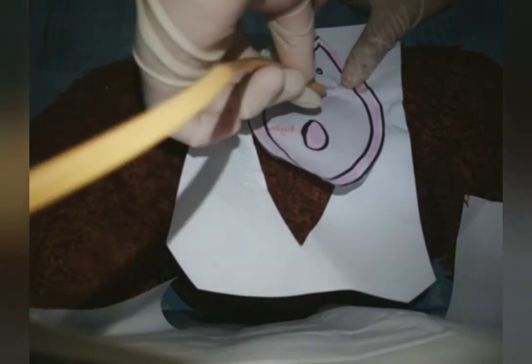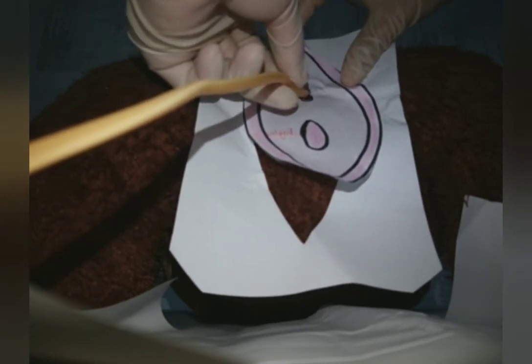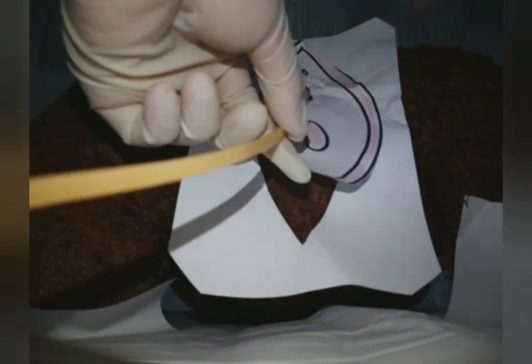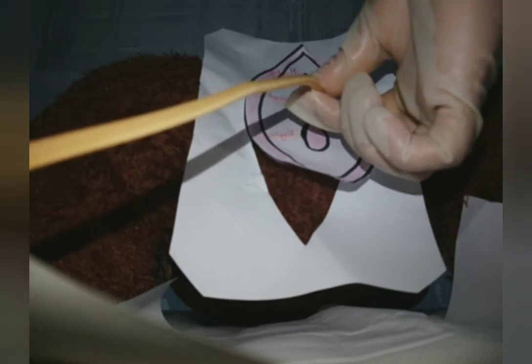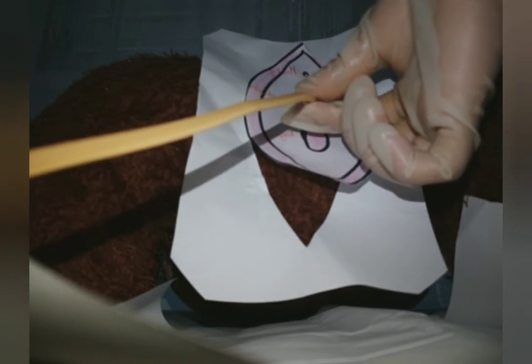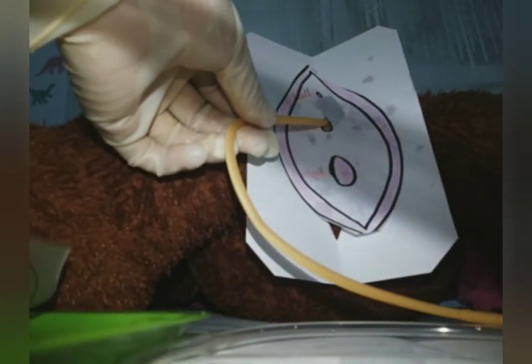So I will insert 1 to 2 inch in advance to be sure that it is fully in the urethra. So you will be successful when you see the urine in the catheter. So now with my non-dominant hand, I will hold, and with my dominant hand I will inflate the balloon. During this process, like when you're inserting the catheter, do not force the catheter into the urethra, which can damage the urethral tube. I will gently pull the catheter to feel the resistance.